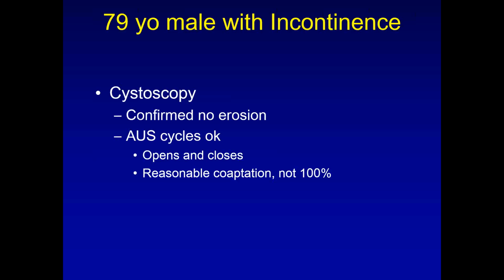We confirmed that his sphincter was functioning fine. There was no erosion. It opened and closed. You could actually see with the cystoscope the urethra compress and open. Not 100%, but pretty good.